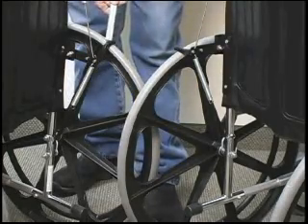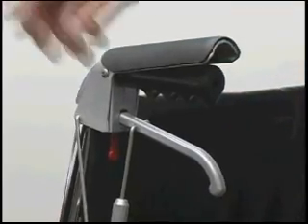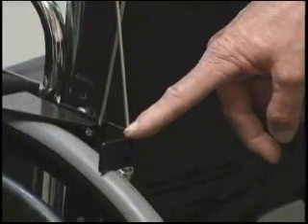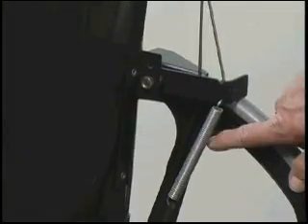The attendant brake system features a padded palm release lever, mounting block for the palm release lever, actuating rod adjustment, brake lever, mounting bracket for the brake lever, spring tension adjustment strap, spring tension anchor hook.